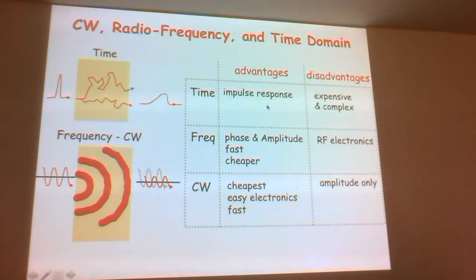At the opposite extreme are the time domain measurements. These are very expensive because you need a pulsed laser that needs to be picosecond pulse of light, and then you need the even more expensive detectors that can resolve this temporal point spread function that is typically broadened out to 1 or 2 or 3 nanoseconds at most. And you really want to have better than 300 picosecond temporal resolution of that temporal point spread function, if not tens of picoseconds. In between, you have this nice happy compromise, frequency domain.